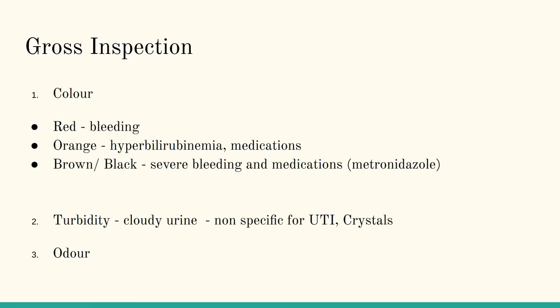Turbidity is the presence of cloudy urine. This is a non-specific marker for urinary tract infections, or UTIs, and for the presence of crystals in urine.